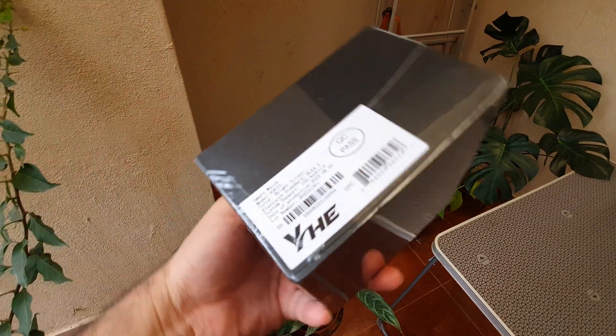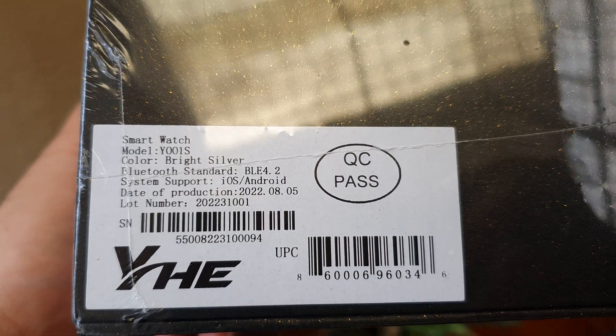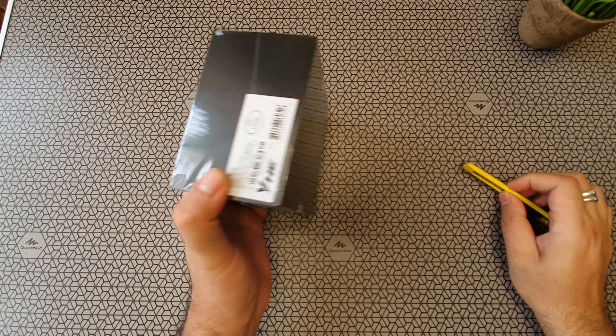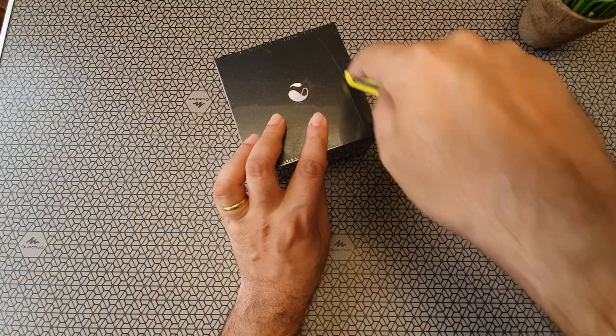This comes in a nice black box. Nothing mentioned on it, just YHE Technologies. This is called the Y001S — it's a smartwatch which is specifically built to take accurate blood pressure readings. Let's open the box and find out how good this is.